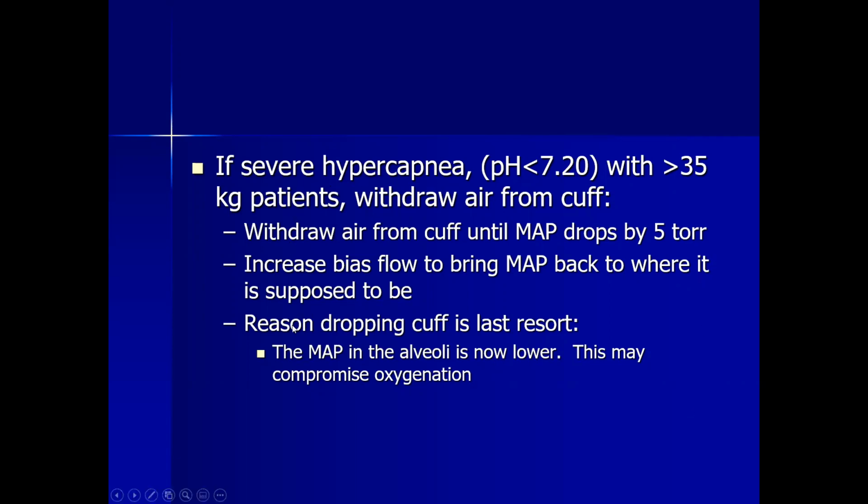And then it says, don't just do this, because the mean airway pressure in the alveoli is now lower, and this can compromise oxygenation. So if your O2 sats start to drop when you do this, it's not working very well.